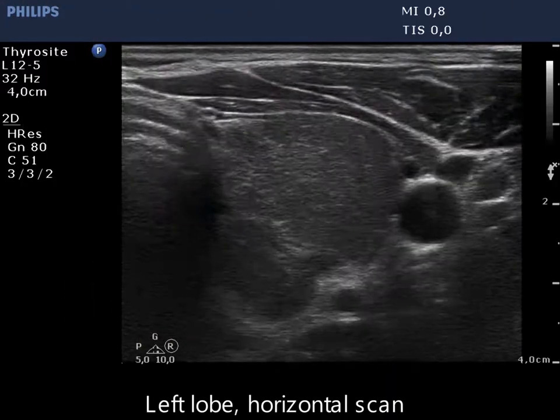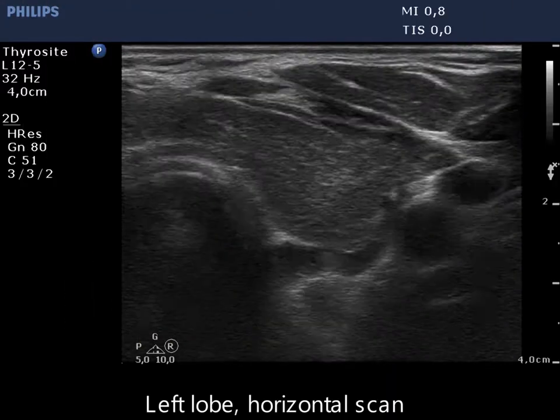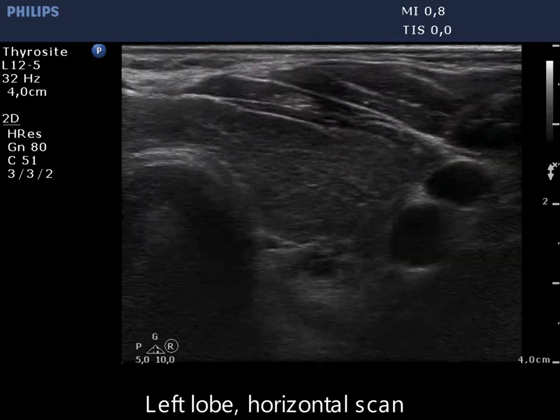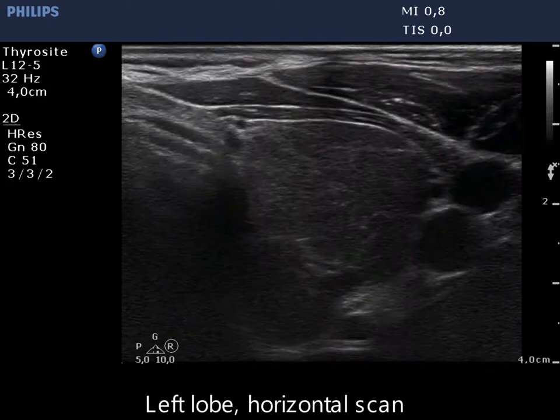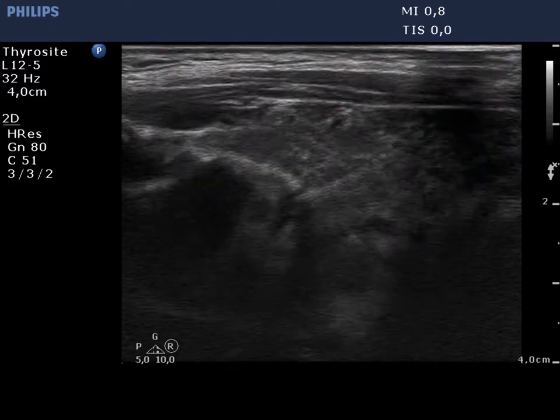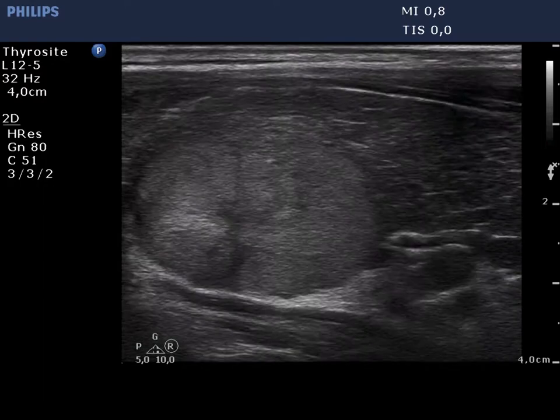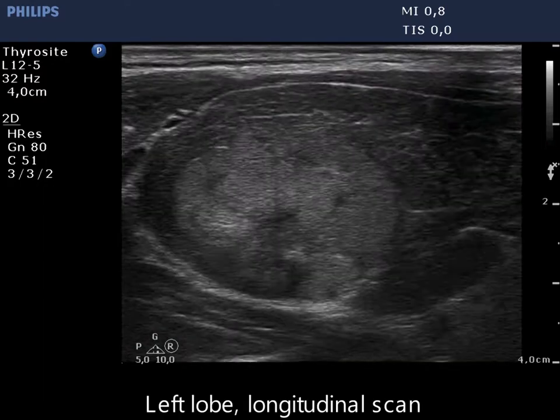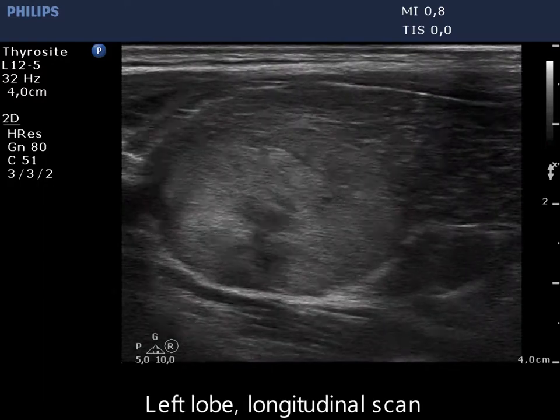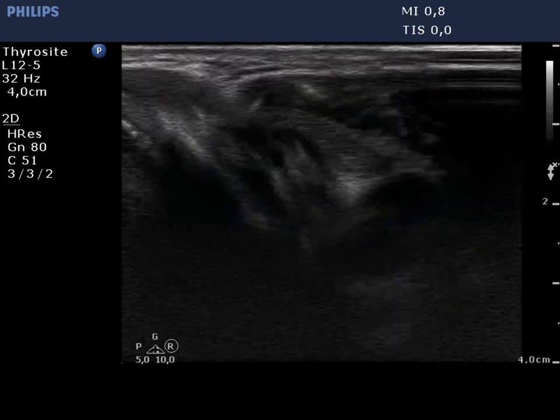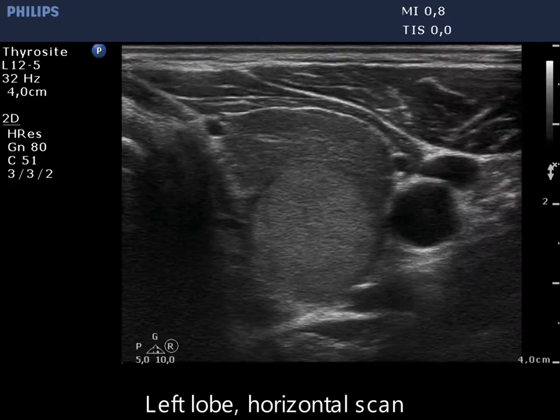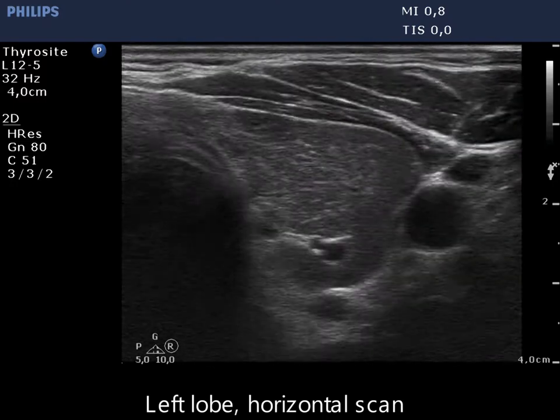The thyroid is moderately hypoechoic and inhomogeneous, corresponding to the underlying thyroiditis. There is an isoechoic nodule in its dorsal part. The contour is abutting and the capsule is invisible in the medial part of the nodule.